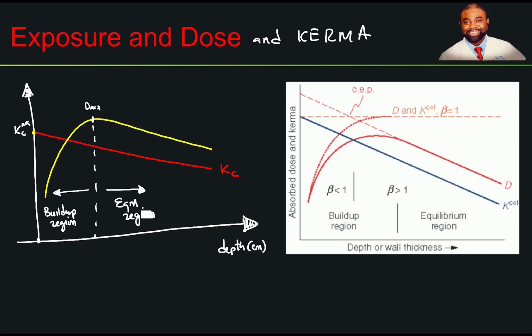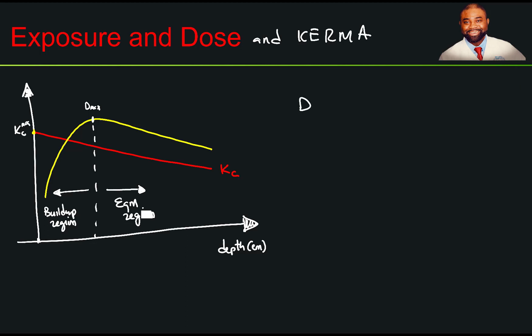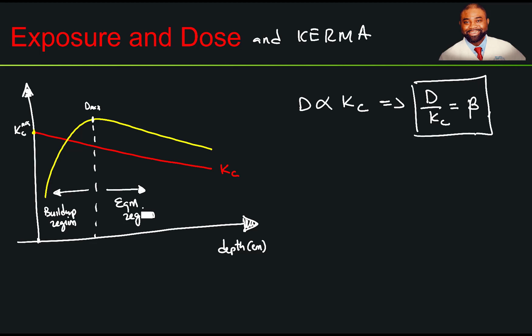From our previous slides, we had discussed the fact that the dose deposited in a given medium is proportional to the collision KERMA.